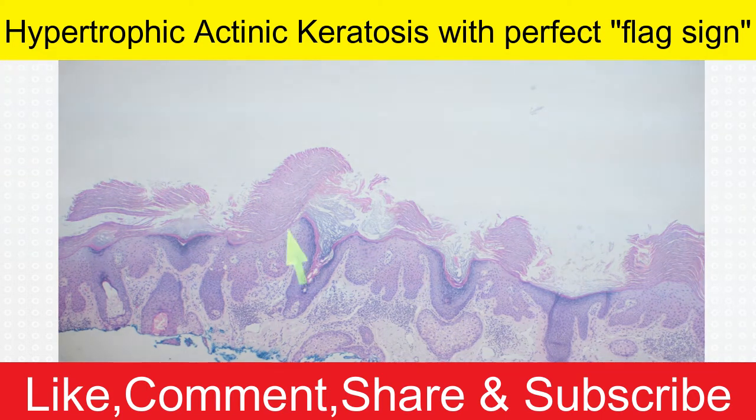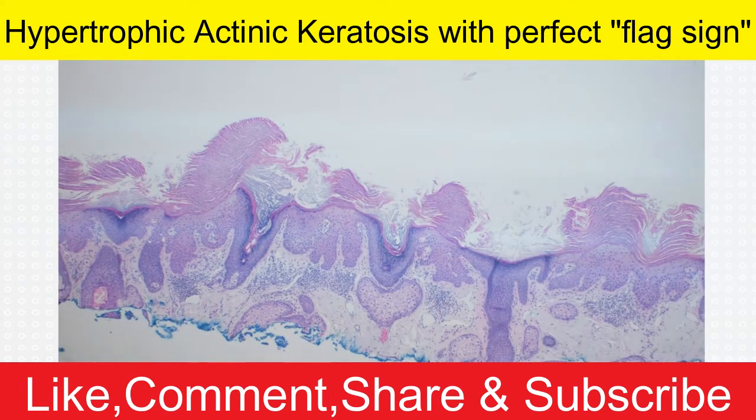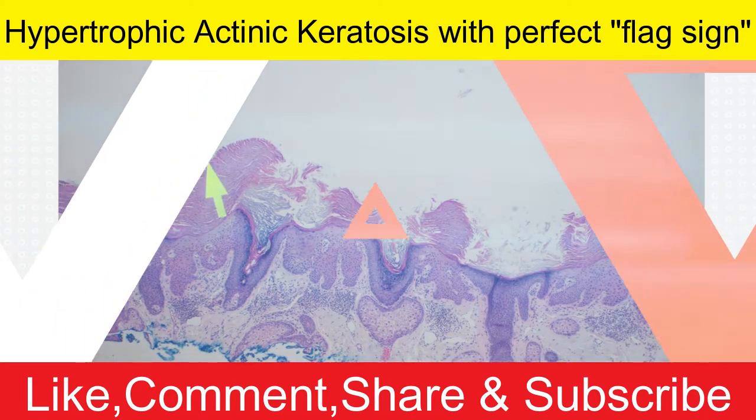Hyperkeratotic means that the corneal layer is thick. Hypertrophic means that the epidermis is thick. And in all honesty, it's probably a bit of a misnomer because it's probably more like hyperplasia rather than hypertrophy. But in any case, I would call this a hypertrophic actinic keratosis, and this is the flag sign. If you've got a good imagination, this looks like a flag.